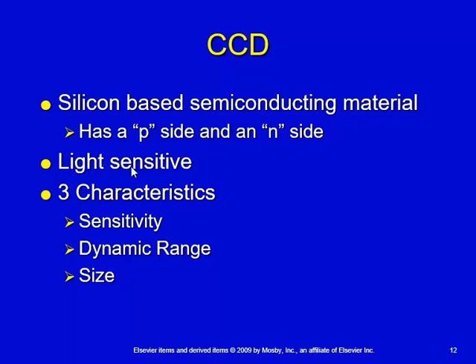So it's light sensitive, and it has three characteristics, and that is sensitivity, dynamic range, and size.